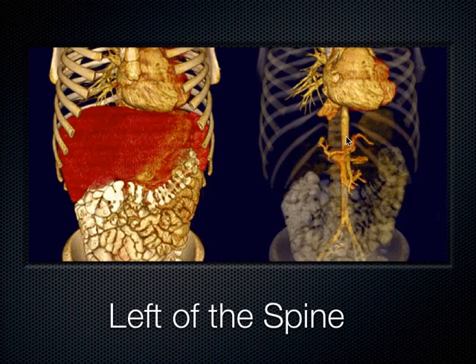Here is the aorta coming down the left side of the body, correct? Here's the heart. So after it comes out of the chest into the abdomen, that's when you can see it. You can't see it up here in the chest with ultrasound. That's one of the limitations of ultrasound. You can't see a thoracic aorta, but you can see the abdominal aorta very, very easily. You just keep pushing down until the spine shadow comes into play.